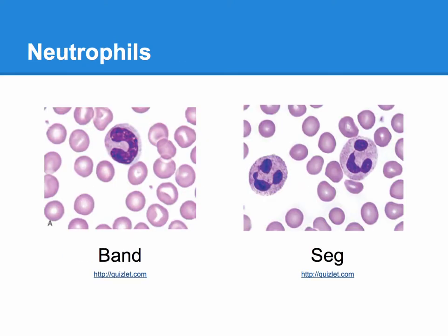Neutrophils are more frequently found, usually about 50 to 65 per 100 leukocytes. Neutrophils have a purplish-red nucleus in a Wright-stained smear that will have 2 to 5 lobes called a segmented nucleus, or seg. However, the nucleus of younger neutrophils may instead be banded, looking like a C. The granules in the cytoplasm are small and look like red or purple dots. The purpose of neutrophils is phagocytosis, or eating bacteria. Neutrophils also secrete chemicals to enhance an inflammatory response.